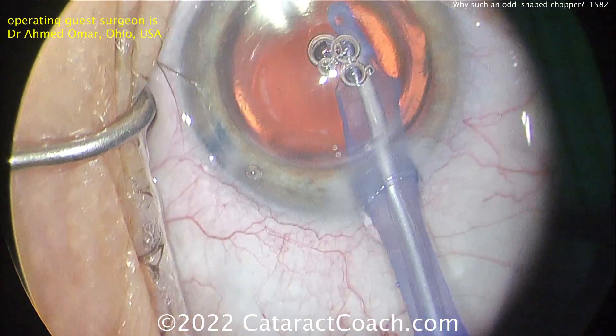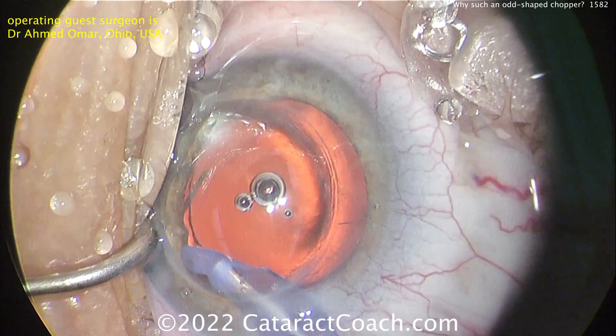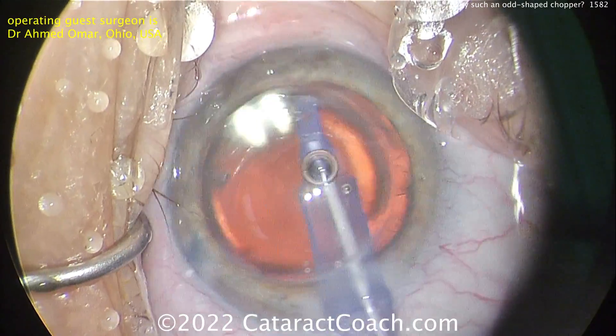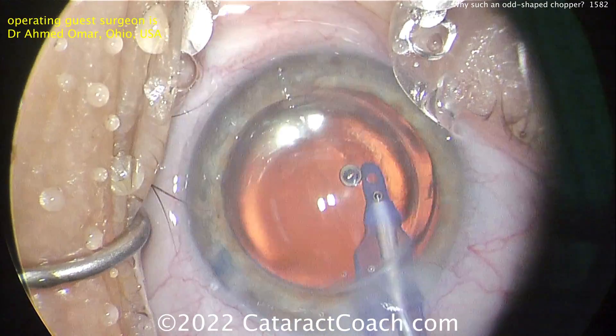Notice how this surgeon, Dr. Omar from Case Western, did a beautiful job. Very important — he did not let the phaco incision come near or intersect the graft-host junction. So in a case like this, either do an incision like you see here or do a scleral tunnel. The end result looks fantastic. Great case — thank you guys for watching.